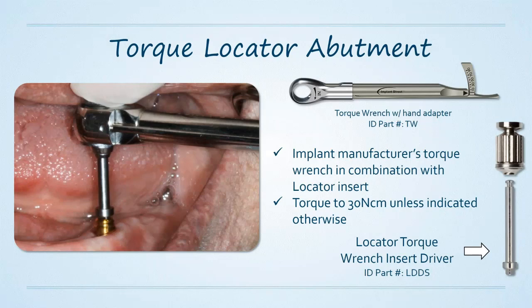What we need to do is torque according to our implant-specific manufacturer guidelines, so make sure you look it up in your particular Implant Direct catalog for your implant system. What I can tell you is the vast majority are going to be torqued down to 30 Newton centimeters. Make sure you check your implant system and your catalog prior to doing that.